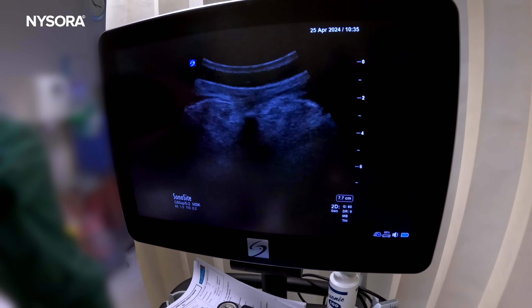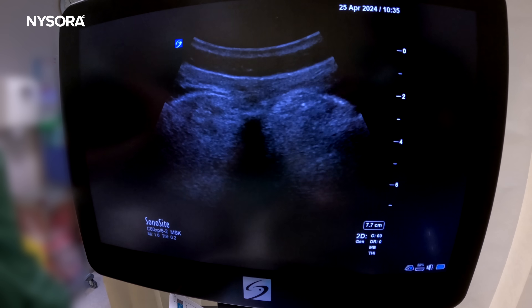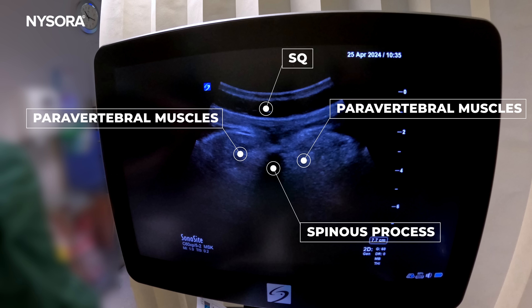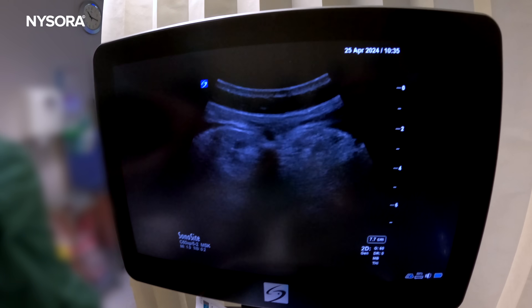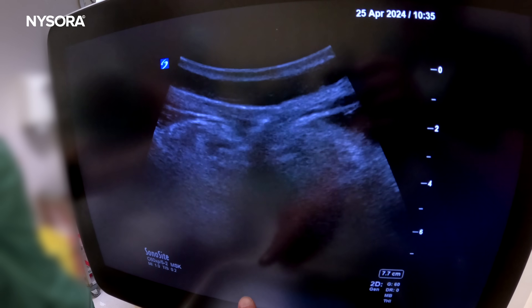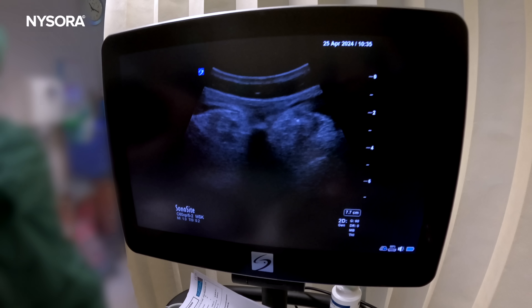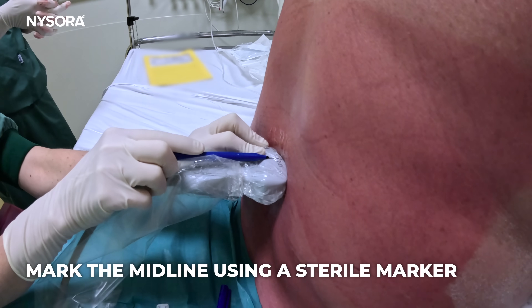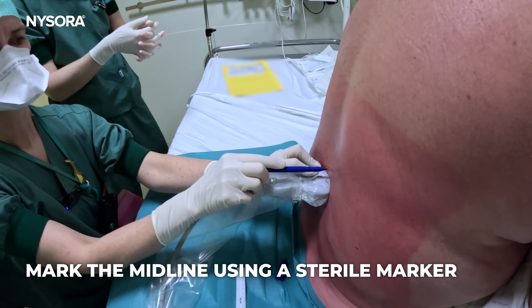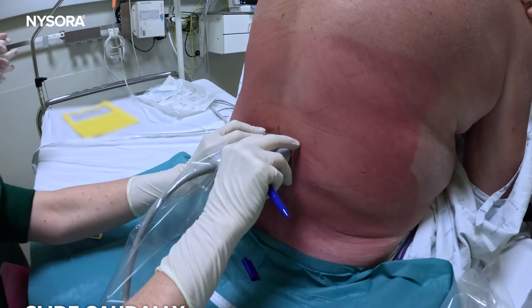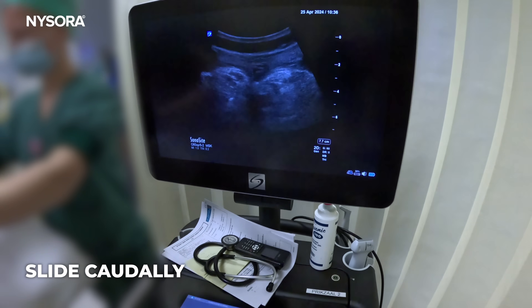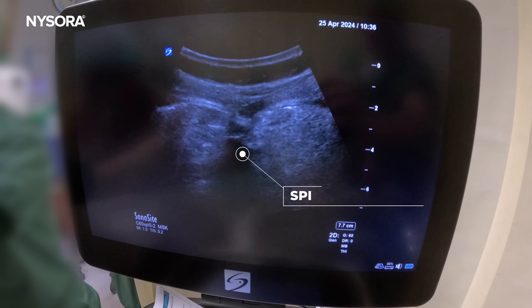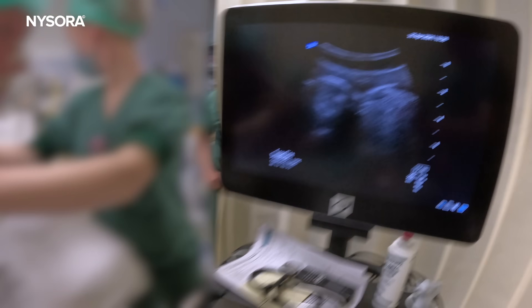To find a spinous process, you can see that black acoustic shadow — that's a spinous process, and that gives us the midline. What you can do is take a sterile marker, place it in the middle of the screen on the ultrasound, and then you will know that the middle line on the ultrasound transducer represents the midline. I'm going to move the transducer a bit down, find another spinous process, and put a little mark.